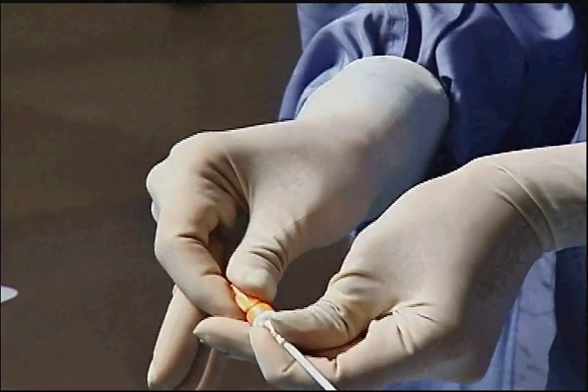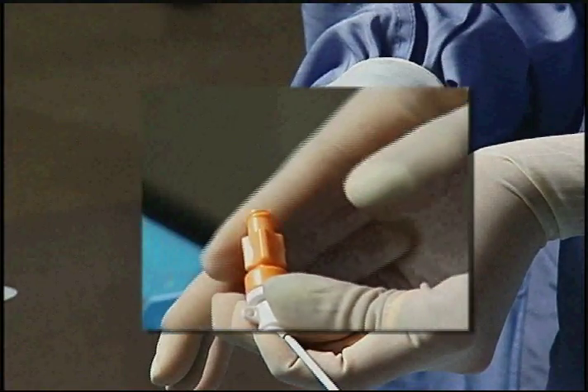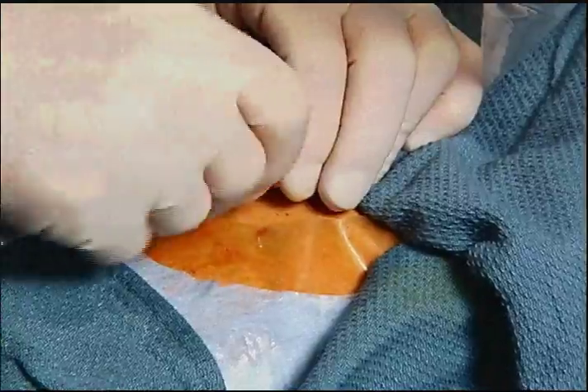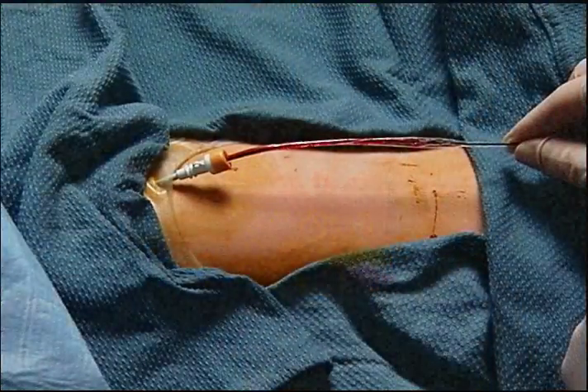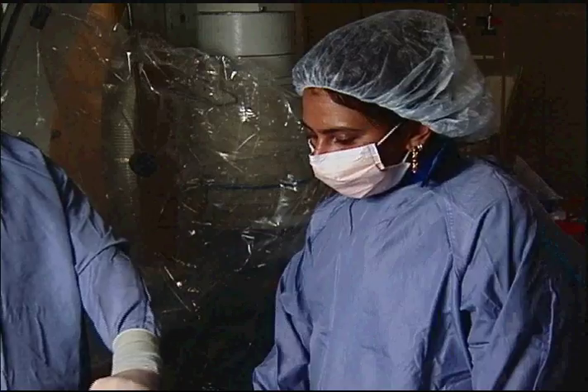Be sure to secure the dilator to the hemostasis valve. This will prevent the sheath from slipping ahead of the dilator, reducing the potential for damage to the sheath and the artery. While the pre-folded balloon membrane is easily inserted through the sheath, its smooth longitudinal folds can sometimes act as a conduit for arterial blood under pressure.